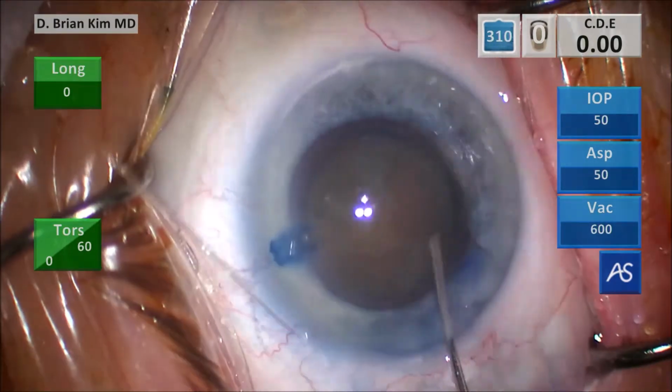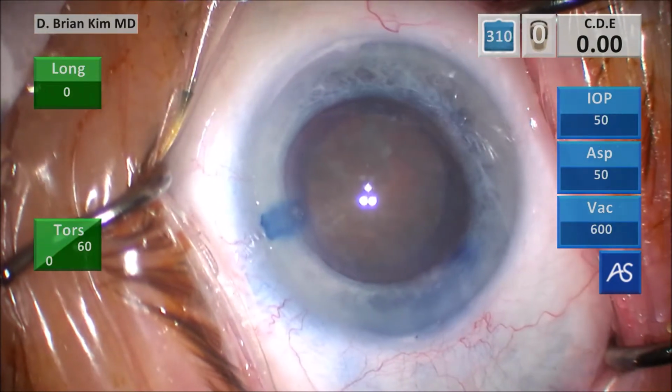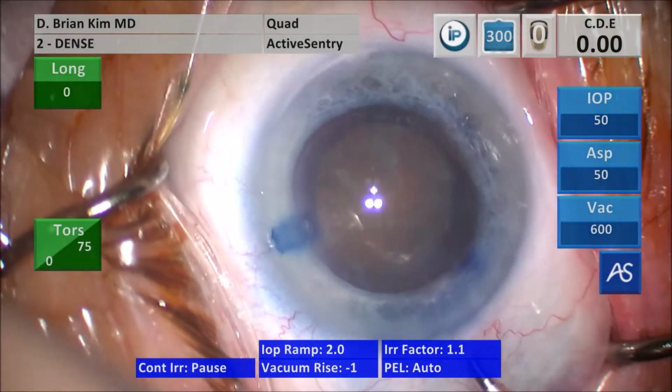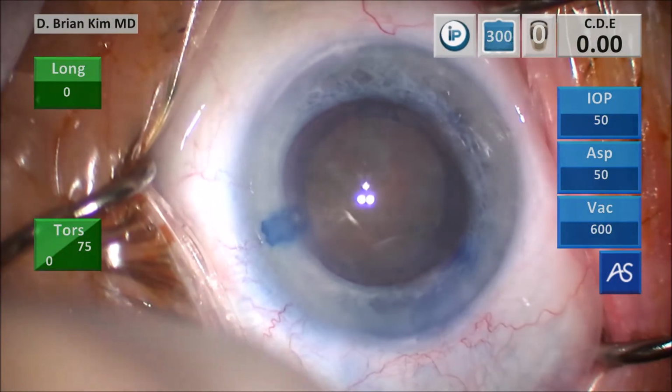Oftentimes, these really dense lenses tend to have loose lenses, and that's partly because there's so much liquefaction and hardly any epinucleus in these cases. This is the opposite of the sticky lens. Adjusting the sleeve.